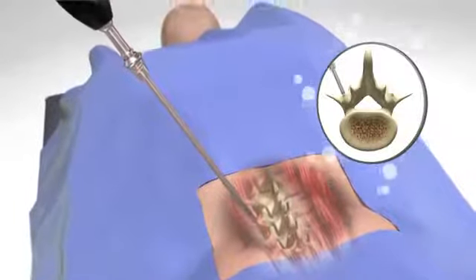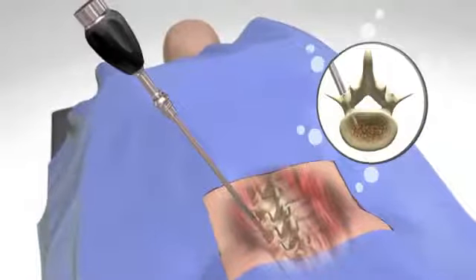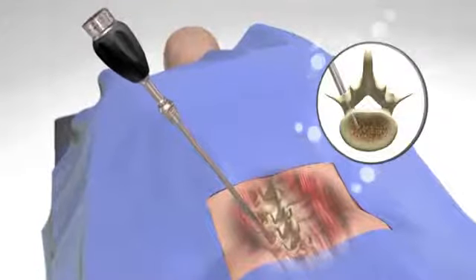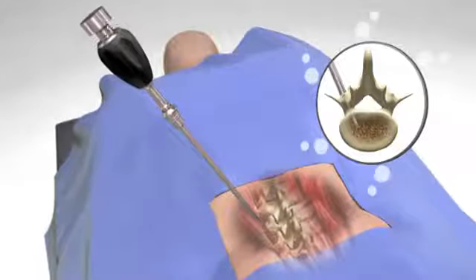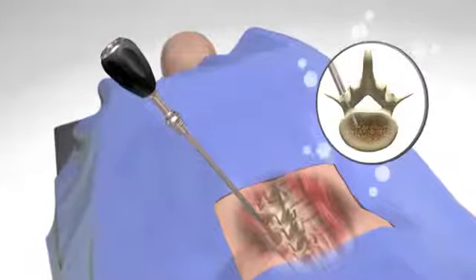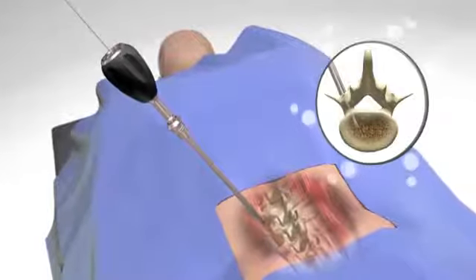Continue to advance the cannulated awl under fluoro. Keeping the cannulated awl in place, remove the inner stylet and advance the guide wire.